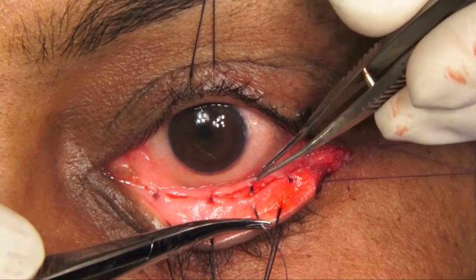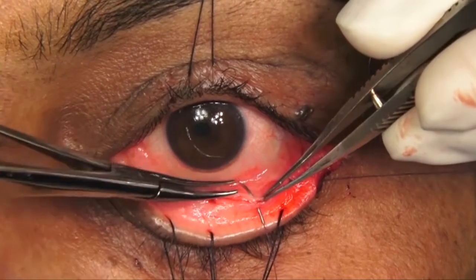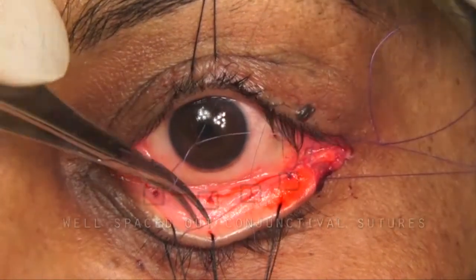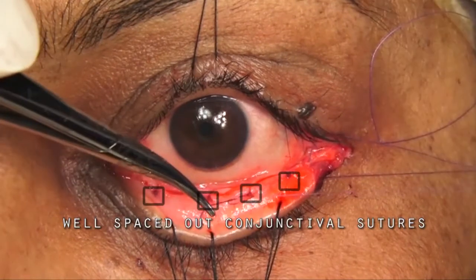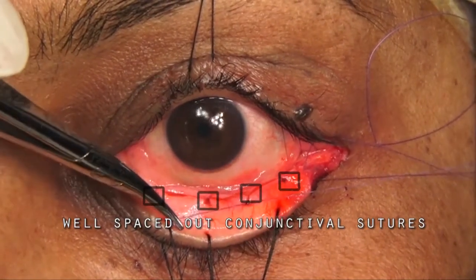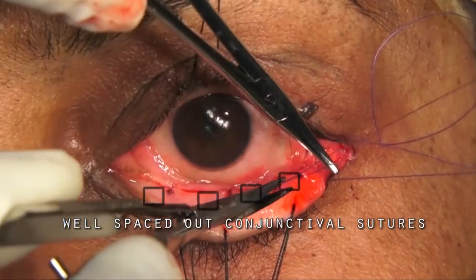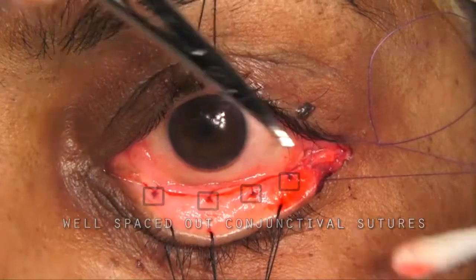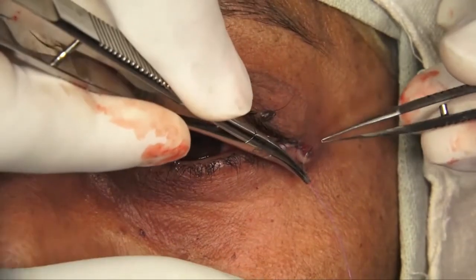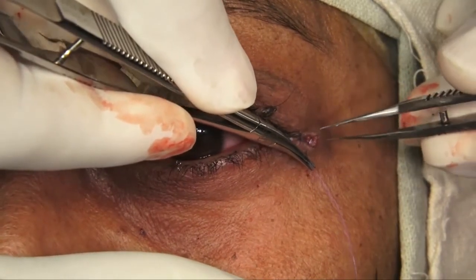Conjunctiva is closed with interrupted sutures using 6-0 vicryl without suturing the periosteum. Lateral canthotomy is repaired with 6-0 vicryl suture.